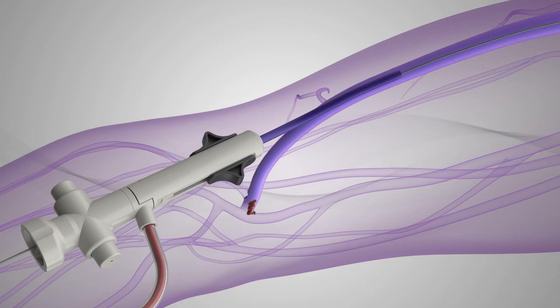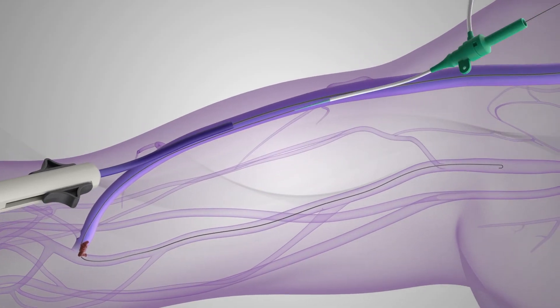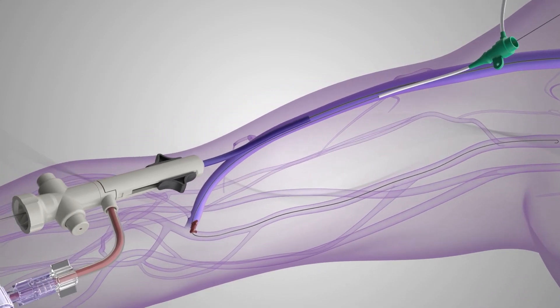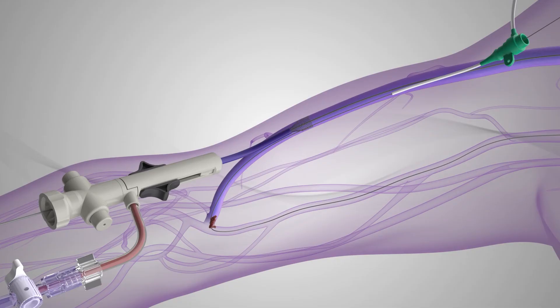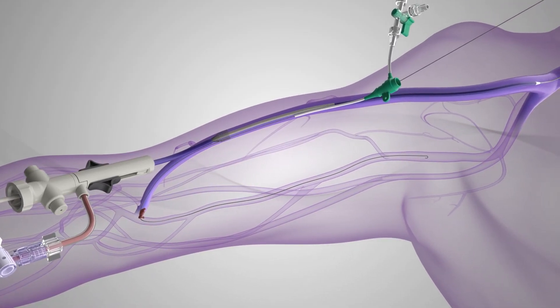To remove the arterial plug, ultrasound guidance is used to gain a second access further up the arm in the vein facing the arterial inflow. A .035 guide wire is advanced past the captured funnel of the Inthril sheath and into the arterial limb of the fistula or graft. Then, the second access site is dilated to accommodate a secondary arterial sheath. Once the secondary arterial sheath is placed, the Inthril sheath funnel is deployed by retracting the black tabs into the proximal position.